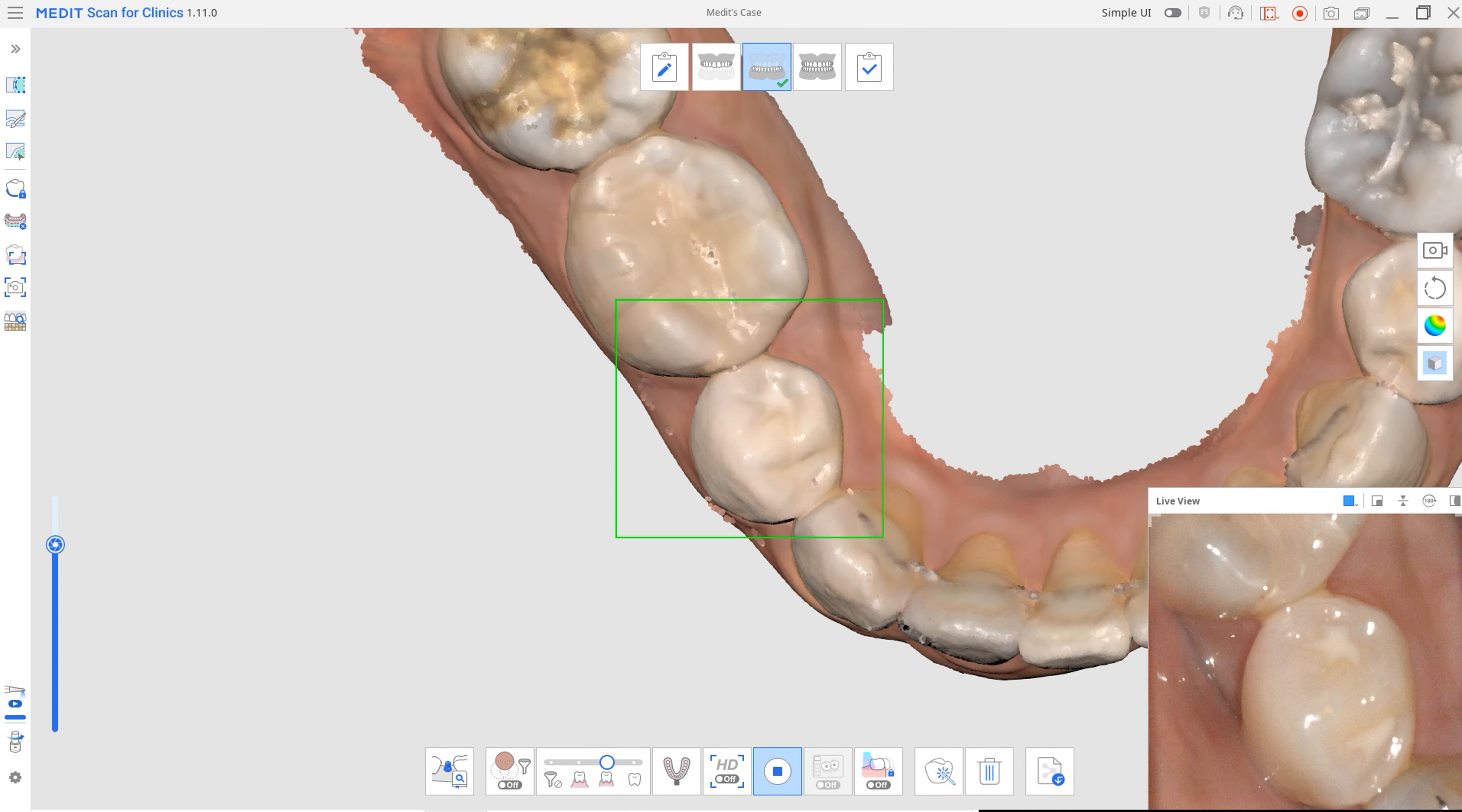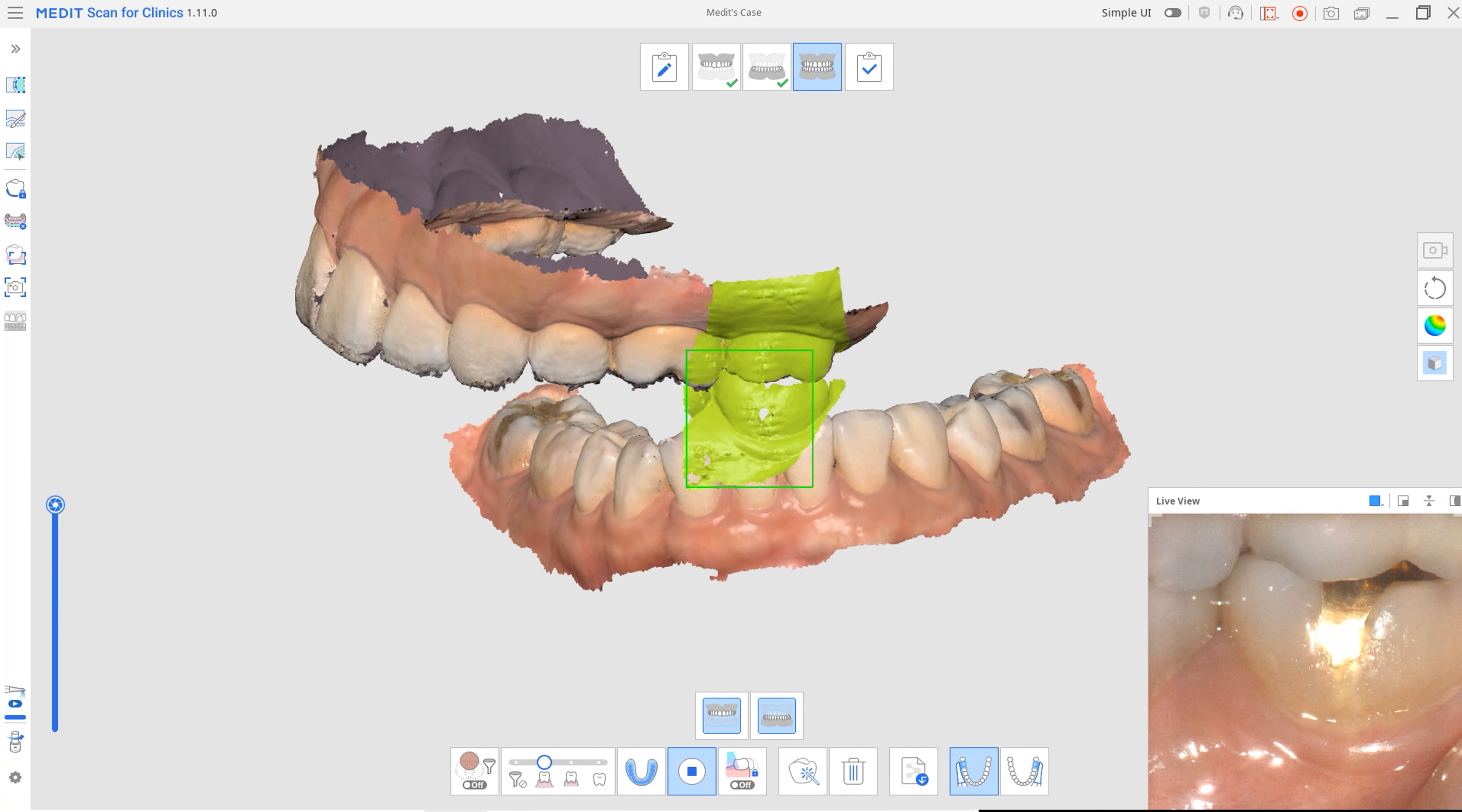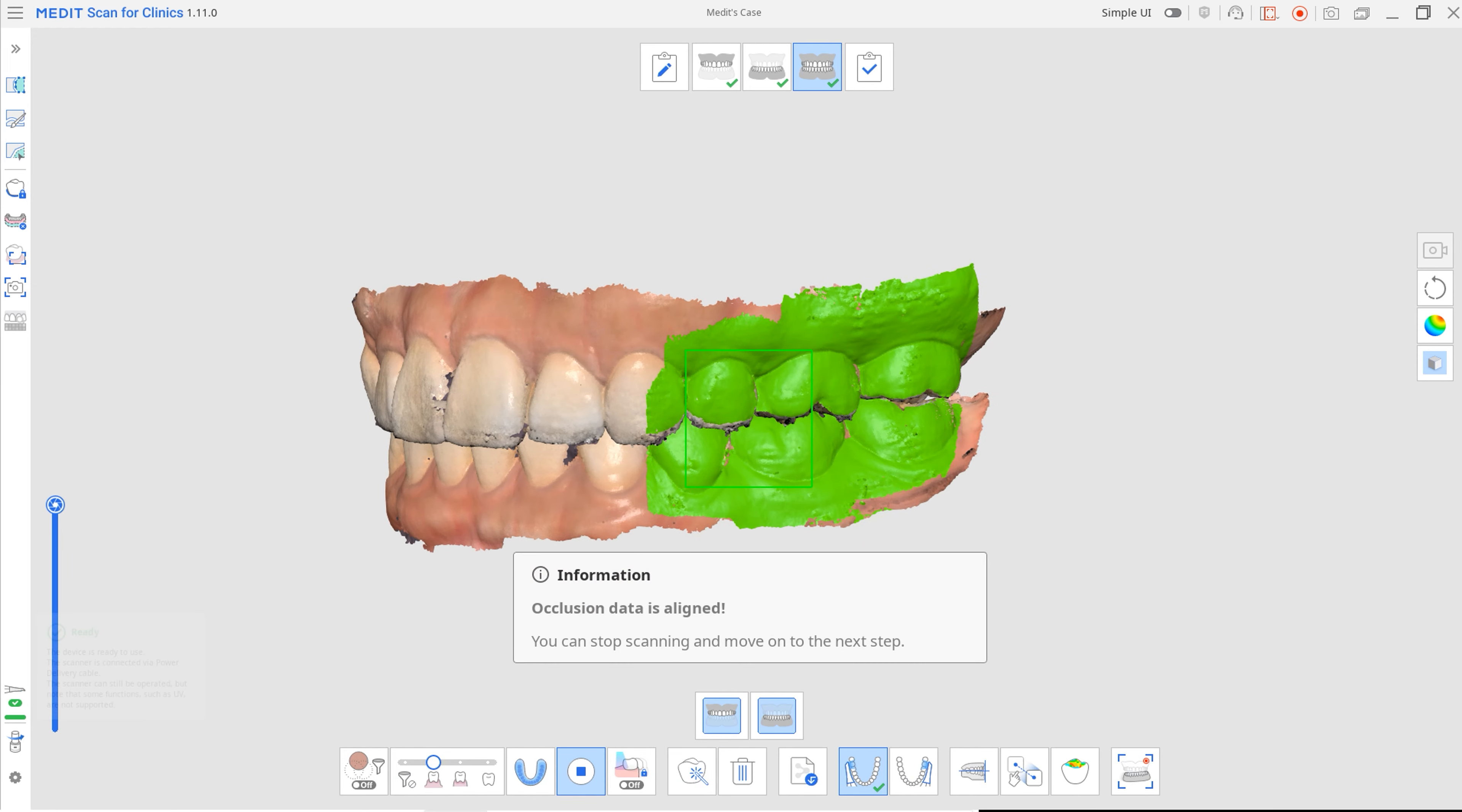Improved prevention of misalignment ensures scan data remains accurate in areas like the anterior region. The improvement also prevents maxillary and mandibular misalignment during occlusal scanning and greatly reduces unnecessary time spent on rescans.